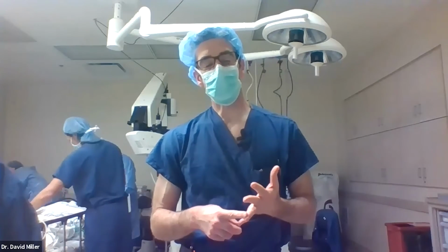So what was interesting in that particular case was a couple of things. One was you had a vitreous separation, you had a pseudophakic patient, that's ideal. The tears were very small. So the toughest thing about being successful in retinal detachment repair is, can you find the retinal break? It's like a game of hide and seek. Those tears can be extremely small, especially in pseudophakic patients. That's as tiny as they get, and I can still find them. So that was a nice challenge to show everybody.